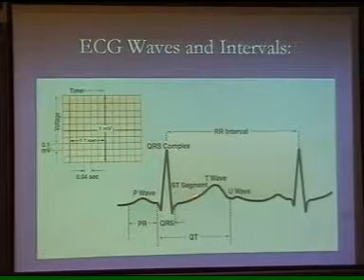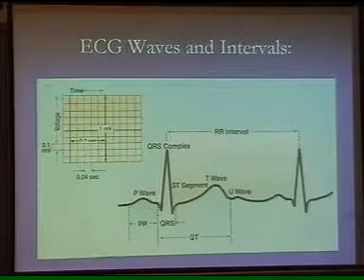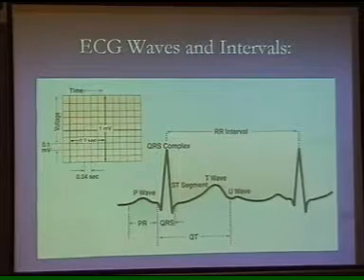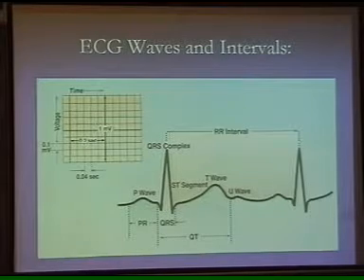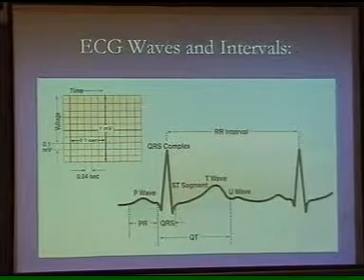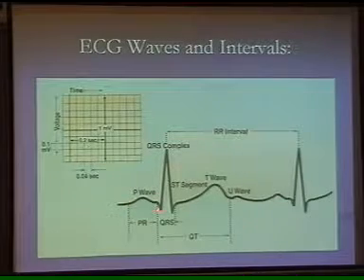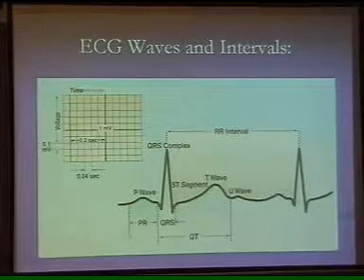And the ST segment is basically a period where the ventricle is in refractory period. And T is the repolarization, right? So therefore you have the whole electrical activity of the ventricle and the atria registered on the paper, showing as P wave, QRS complex, ST and T waves, and U wave if the patient's got bradycardia.